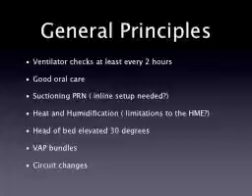Good suctioning, and I did put PRN, and that's as needed. We should never have suctioning on a schedule, that is, we should never order suctioning say Q2 or Q4 hours. Suctioning is really a function of what's going on with our patient, and if there is an indication for suctioning, then we should suction. Otherwise, we don't necessarily need to be suctioning.